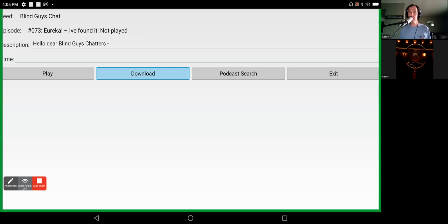Okay, so now it's saying that the content download is complete. So I'm going to press F3 and spacebar to go back up. And now I have a play button. I can press the enter key to play this and also stop it as well.